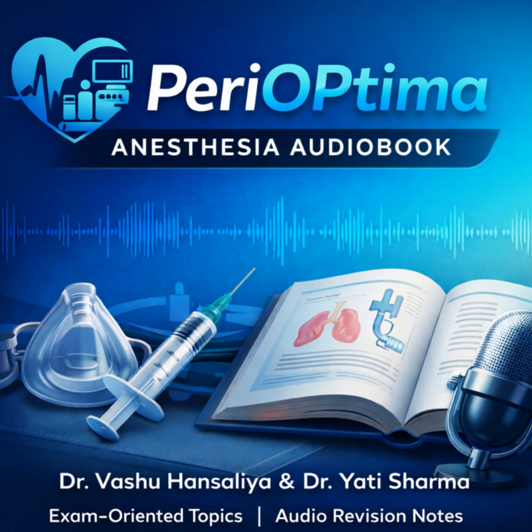I think we should start with the foundations, the stuff that gets you those easy initial marks. So defining our subject. We start with the definition of an SGAD. The key concept, and you have to articulate this very clearly, is that these are devices inserted blindly into the pharynx. Their core function is to provide a patent conduit, a clear pathway for gas exchange. That means ventilation, oxygenation, and of course the delivery of anesthetic gases.